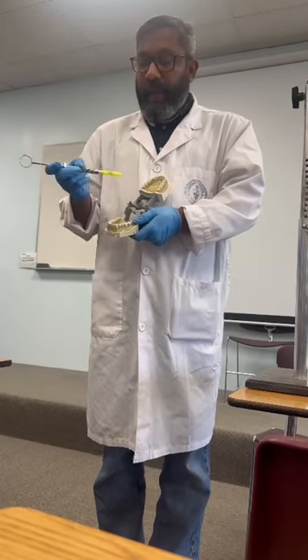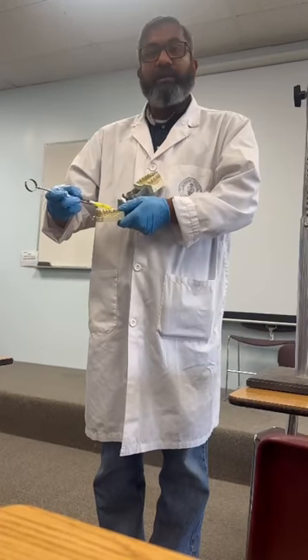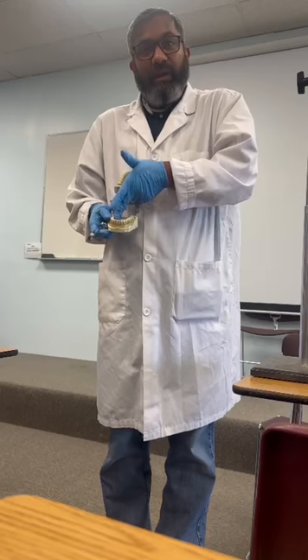After giving half of the cartridge, the dentist will move to block the lingual nerve, because here we have the lingual nerve, which supplies the tongue as well as the lingual surface of the teeth. So the tongue and the lingual surface will be blocked by the lingual nerve.